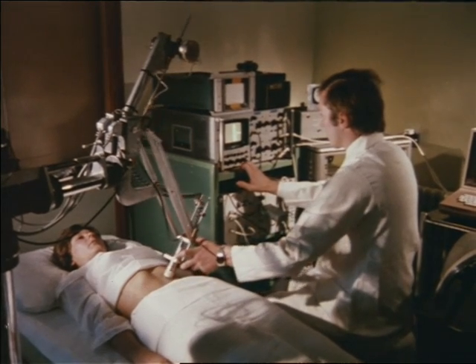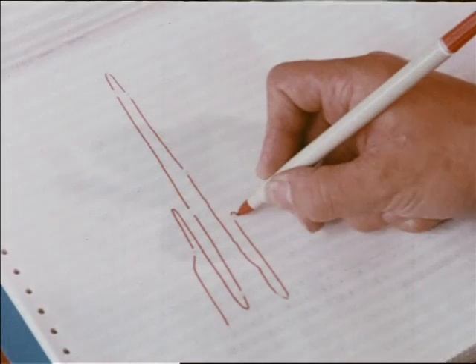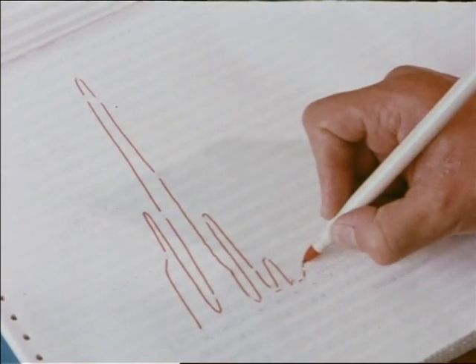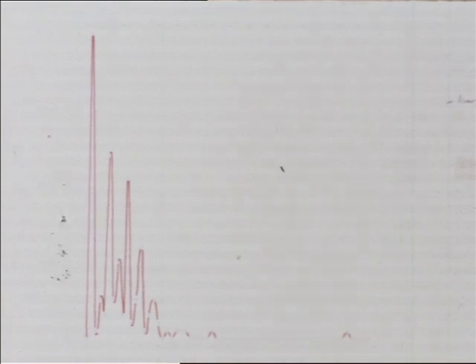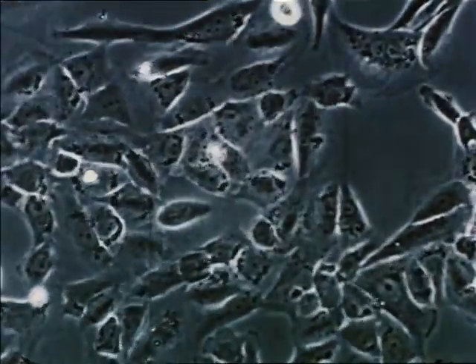But as the transducer arcs to and fro, the reflections change in strength. These variations are plotted out and searched for hidden patterns. When all the dots are connected up, a series of peaks and troughs emerges, a signature of one tiny point in the body. These signatures appear to show the difference between diseased and healthy tissue. They are images of the first signs of cancer deep within the body. They're not the sort of images we're used to, but their significance is that they show the body as it's never been seen before, like the microscope or the X-ray before them.